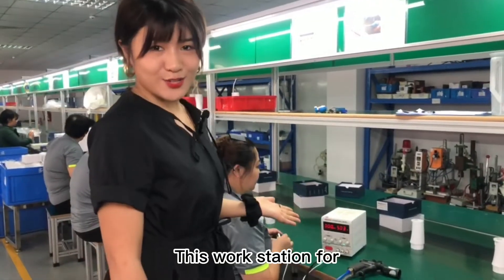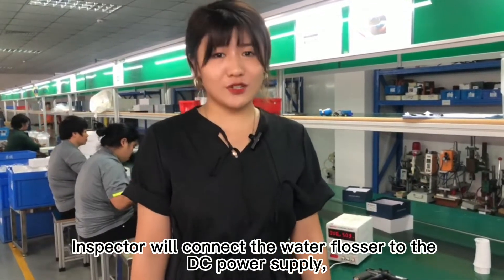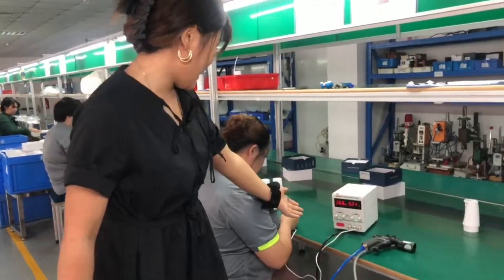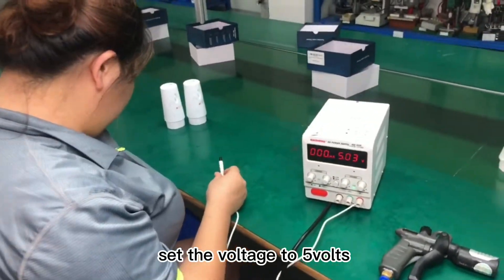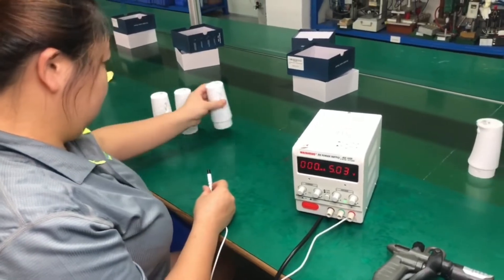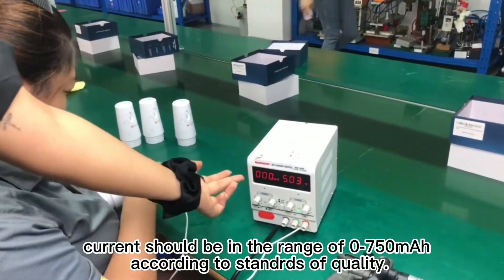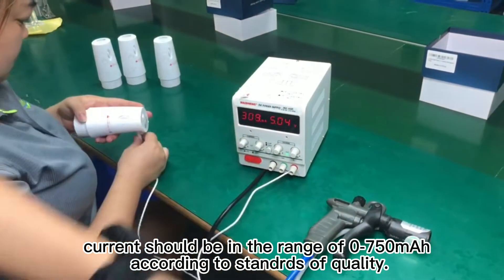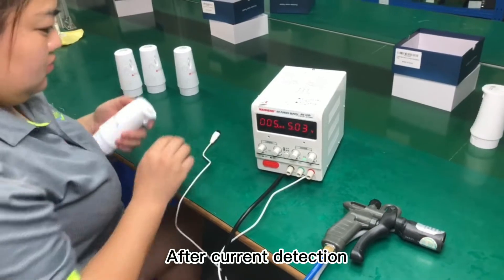This workstation is for current detection. The inspector will connect the water flosser to the DC power supplier. Set the voltage to 5 volts. Current should be in the range of 0 to 750 mA, according to quality standards.